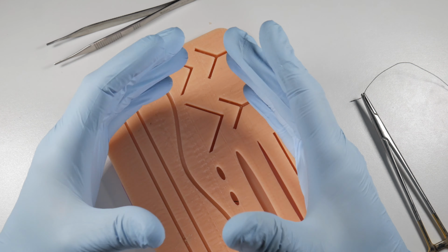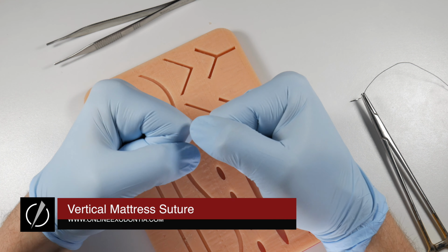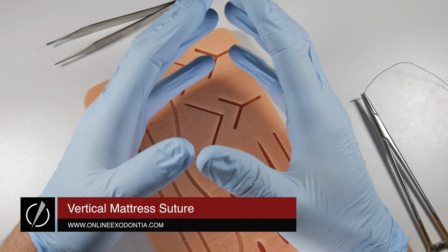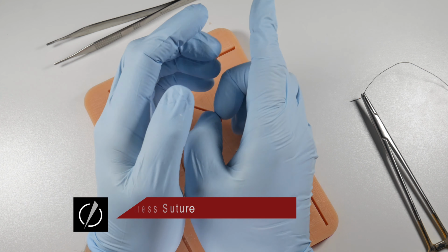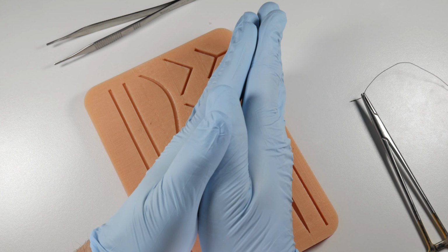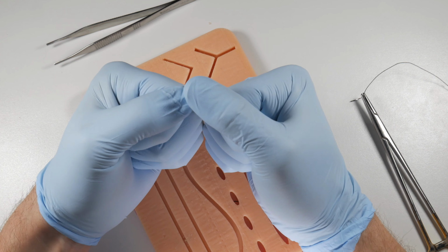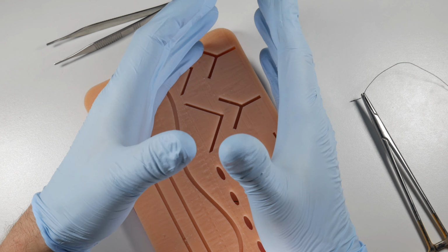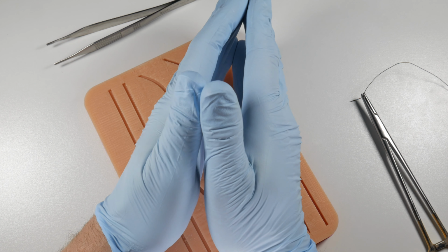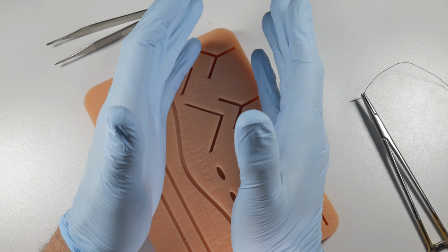Let's imagine a situation where we've got a suture that is under a lot of tension from muscles or edema beneath it. So that incision is under constant stress trying to pull it apart. A situation I could think of would be a distal buccal incision over a third molar site where we're going to have some swelling afterwards. The patient's muscles are going to be pulling against it throughout the entire course of the healing process, and we're trying desperately not to let that incision dehisce so that it heals up nicely for that patient.